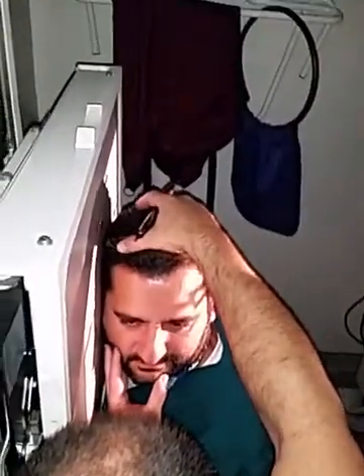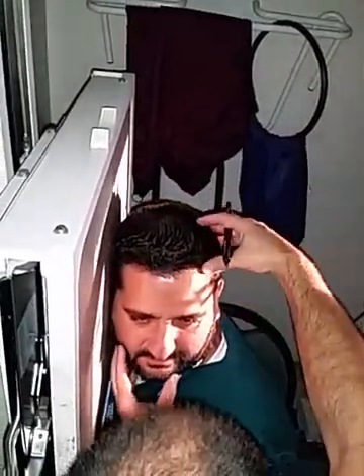Now you really got to play with their faces and everything, huh? Yep, that's true. You can't position people without touching them. Jimmy, wear gloves. So, all right. So now he's in a true lateral position.